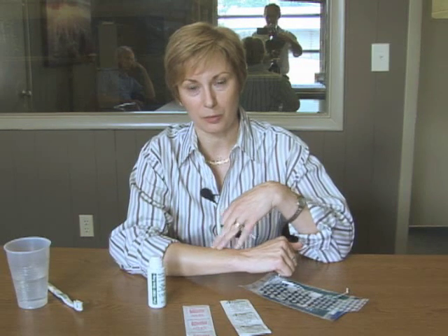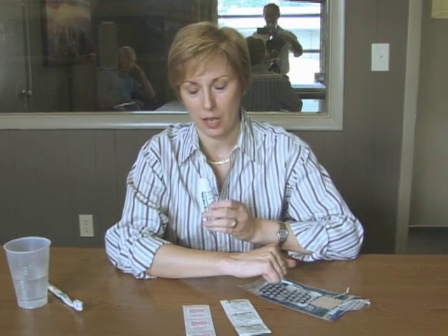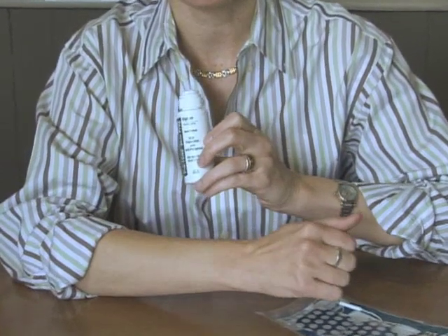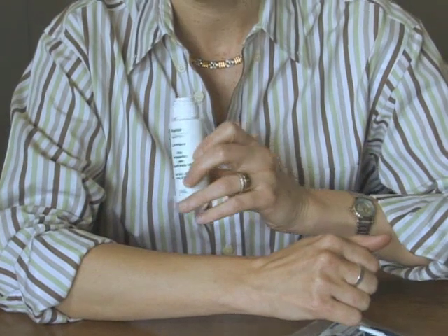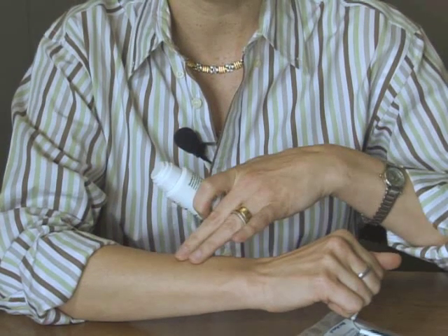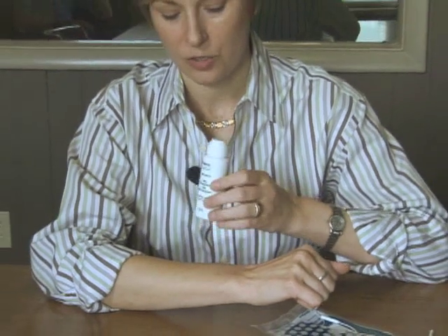The other thing that you want to think about prior to placing them is preparation of the skin. Now, I've said that it needs to be clean and dry, but if you have other issues, such as high perspiration, you may want to consider a skin prep. This here is a pre-TENS skin prep, and this can be used if you have highly sensitive skin, where you've seen after using the electrodes for treatment that your skin is red or itchy or irritated. So you could use this first, and it places a thin coating right over the skin so that you're actually attaching the electrode to that coating and not directly to your skin, but it allows the electricity to flow right through.